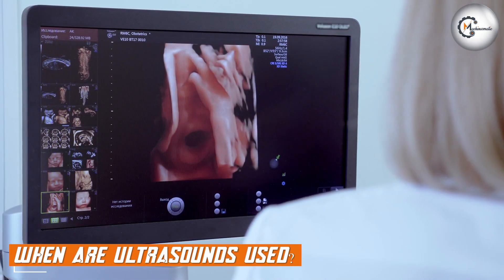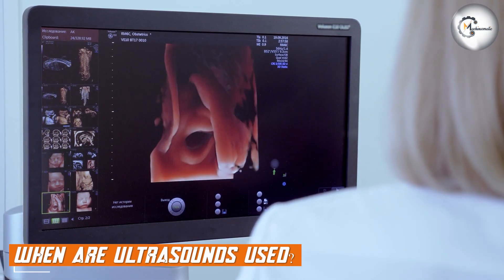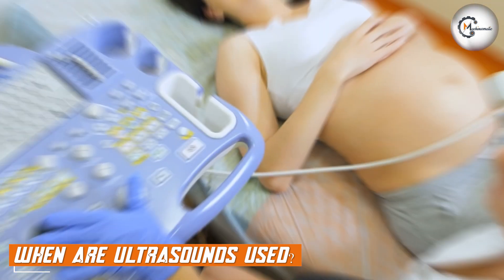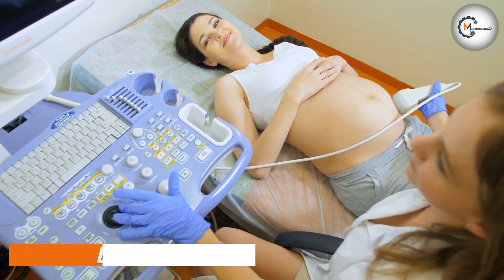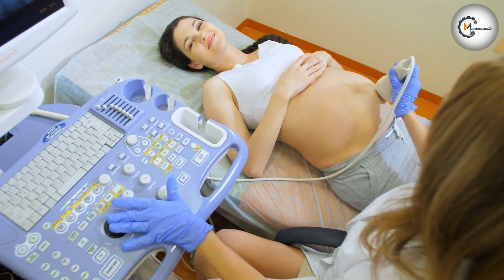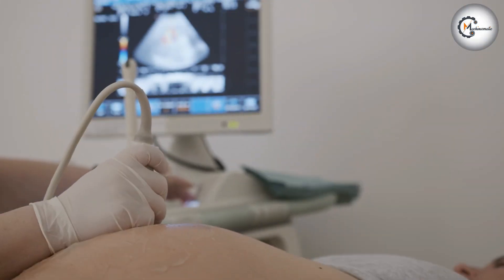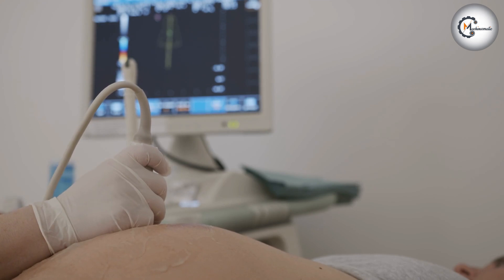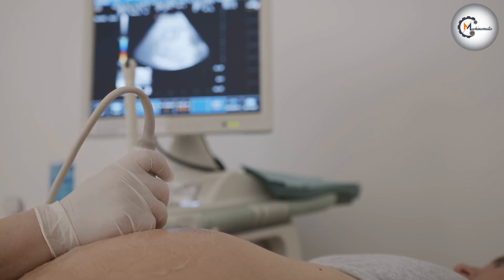Ultrasounds are often used during prenatal care to monitor the growth and development of fetuses. They can also be used to examine the heart, blood vessels, and other organs in the body. Additionally, ultrasounds may be used to guide certain medical procedures, such as needle biopsies or cyst drainages.